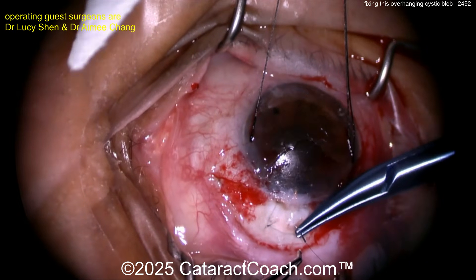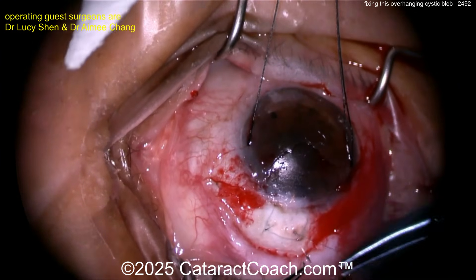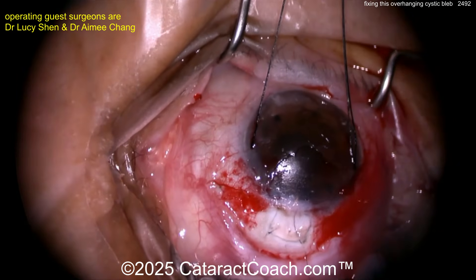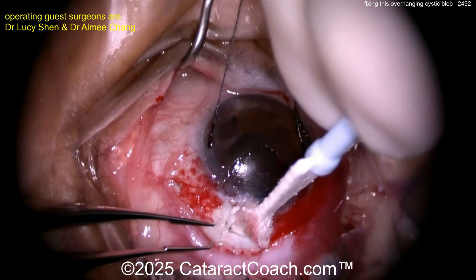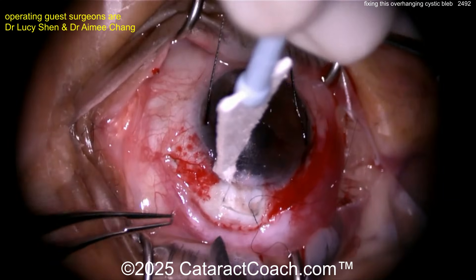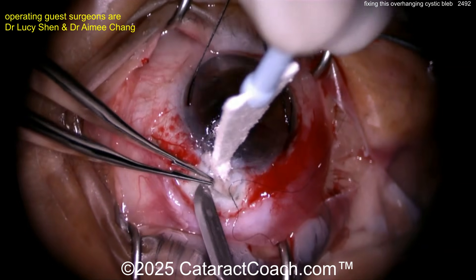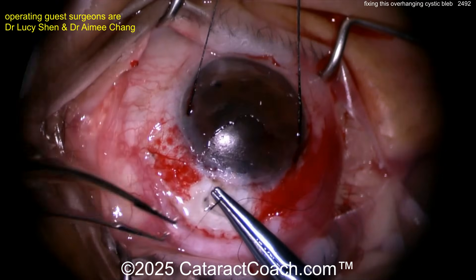Looking pretty good. Of course, after this is done, you're going to test it again. If you have any other adhesions of the sclera, remove them as well. More BSS by paracentesis — testing again, looks pretty good. You want just a little bit of leakage, and then remove any remaining small scar tissue. If you cut a suture out, you may need to replace it.